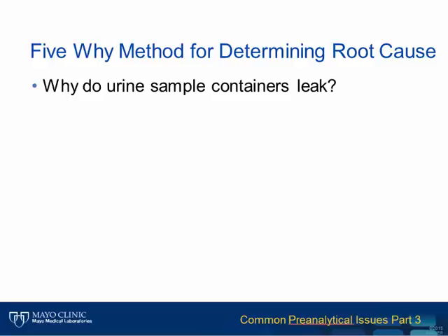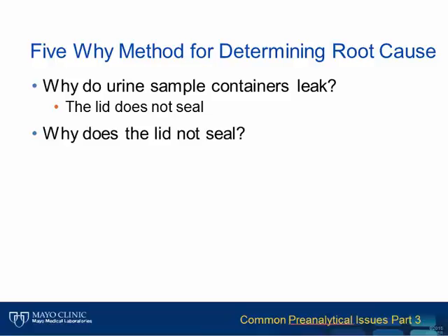Using the 5 why method for root cause analysis, I've started with a basic question: why do urine containers leak? The answer is not all that surprising. The lid does not seal. Next question: why doesn't the lid seal? The answer gets a little less defined.